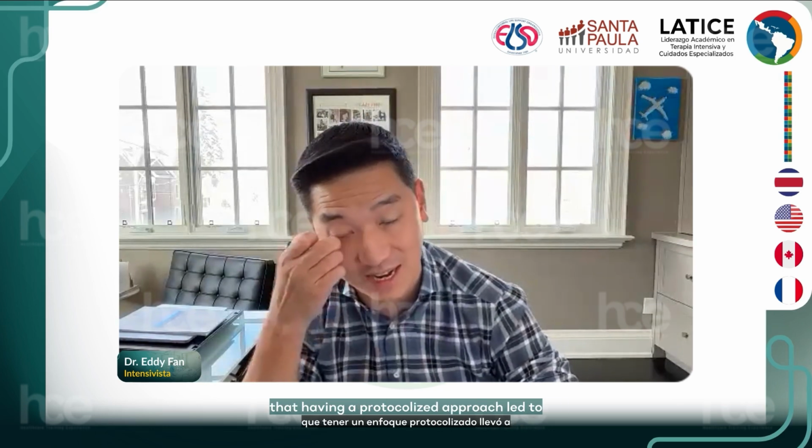So maybe I'll give a plug for an amazing colleague we have here in Toronto, Ricardo Figueroa Paredes, who has spent most of his graduate work on liberation from VV ECMO. The idea was to use the analogy, at least in our center, of all the work done over previous decades on liberation from mechanical ventilation, where a protocolized approach led to benefits in duration of mechanical ventilation, ICU length of stay, and mortality. So we're hoping that very similar effects could happen for ECMO if we take a very standardized approach.